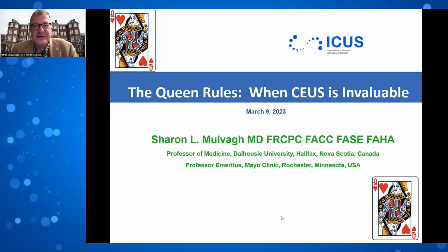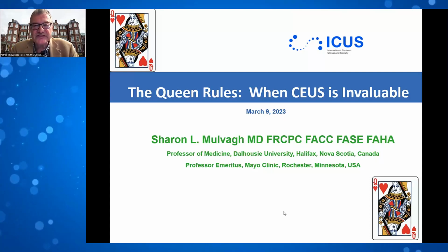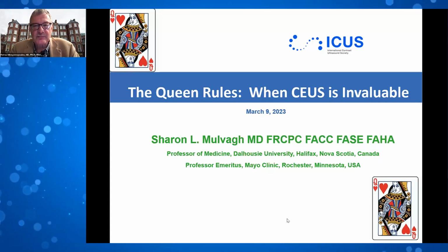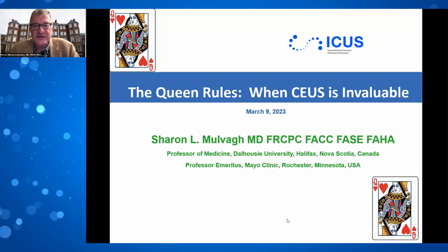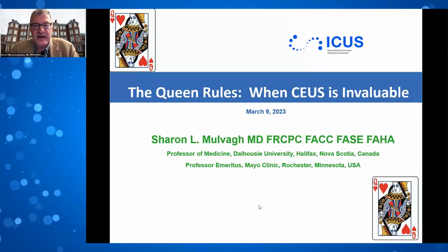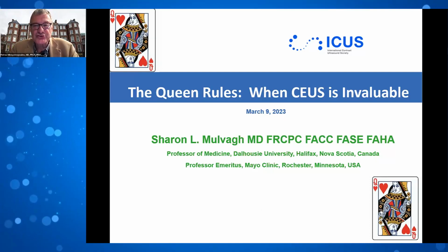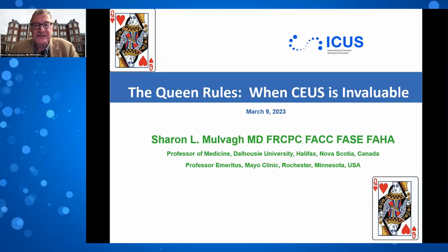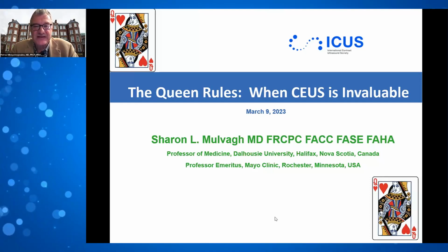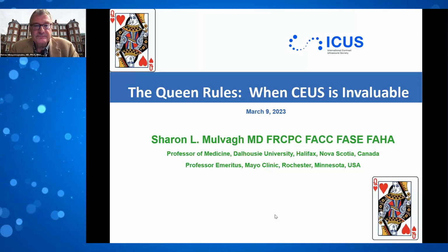Sure. And this is really the role of CEUS in continuing these webinars, so we can train and convince both sonographers and doctors to use contrast in their labs. That they go hand in hand. Sonographers should really request the doctors to allow them to use contrast as often as possible and when needs arise.